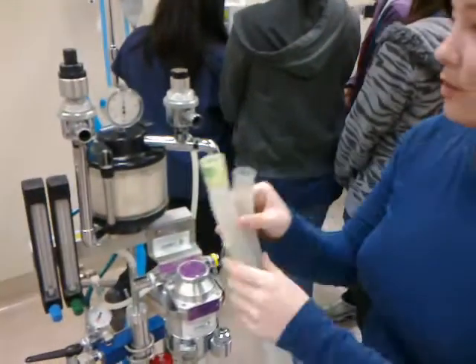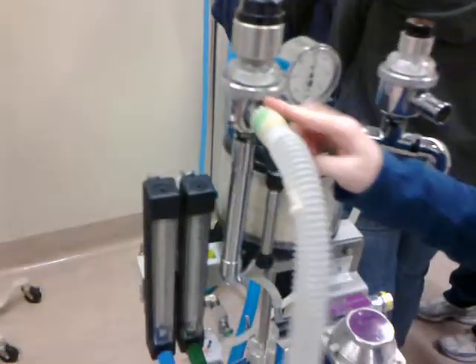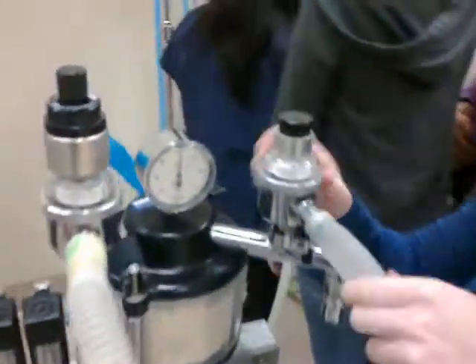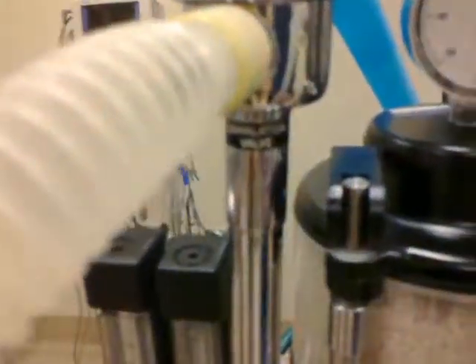This is the portion that goes to the patient on the Y-piece. For expiratory, there. This is the inspiratory, here. It says exhalation valve — exhalation valve — and inhalation valve. You can't really read it, but it says inlet and the reservoir bag. The reservoir bag goes here.